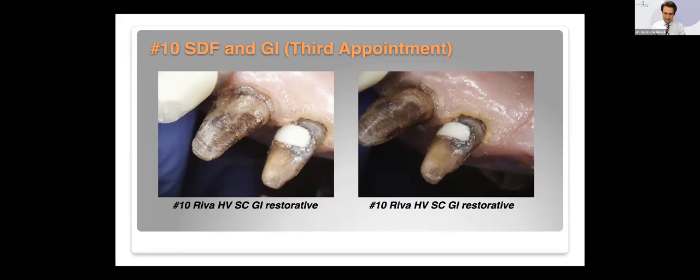Let's say, why wouldn't you take off an old bridge. Why wouldn't you use this almost as a caries-seeking agent that you would paint the tooth, rinse it, let's just say place it on, put your potassium iodide on it, and anywhere that stains, now you have caries and it's effectively treating the caries. Walk me through why we wouldn't use this as today's caries seeking agent.